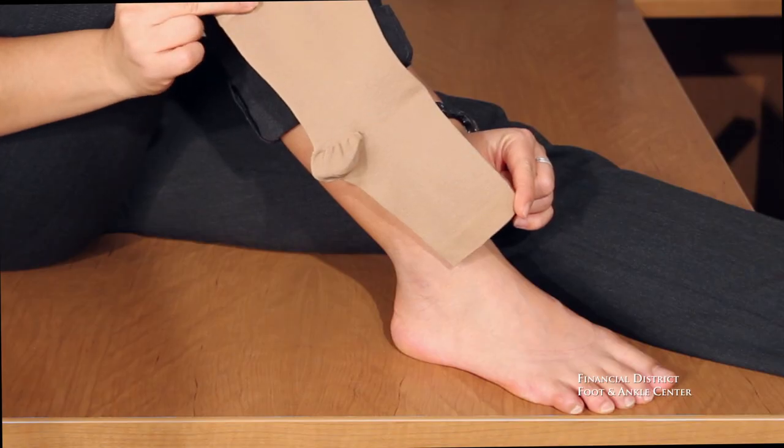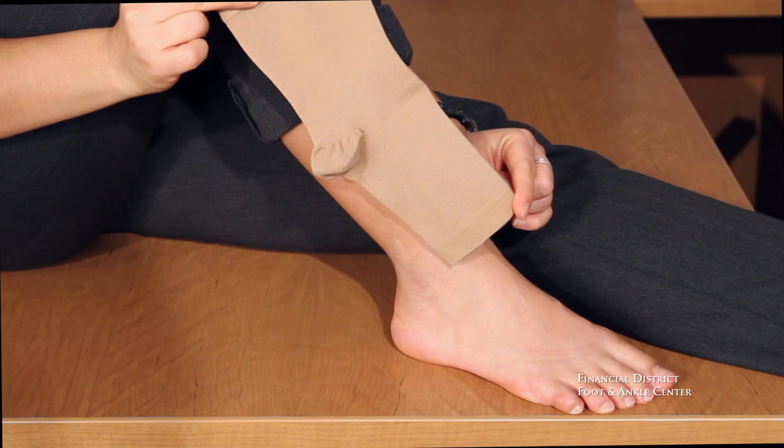We use this device in our office almost daily because it does such a great job at reducing any swelling that you may have. This is an example of a compression sleeve that we dispense at FDFAC.